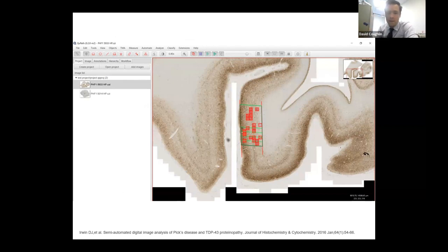And the idea is actually because there are these different layer tropisms where certain neuropathologies like to live at certain levels anyway. And you can even see that with your naked eye here, how the neurofibrillary tangle pathology likes to be in certain levels of the cortex here. And this dropout algorithm helps lessen the bias that might happen with different types of angles of cuts anyway. And this is based on some work that we had done many years ago with the citation below with some of the original validation work.